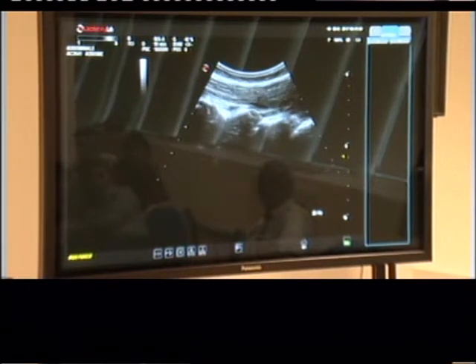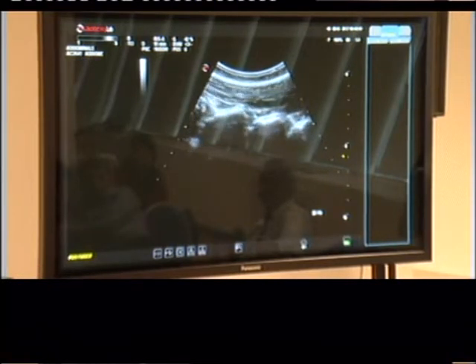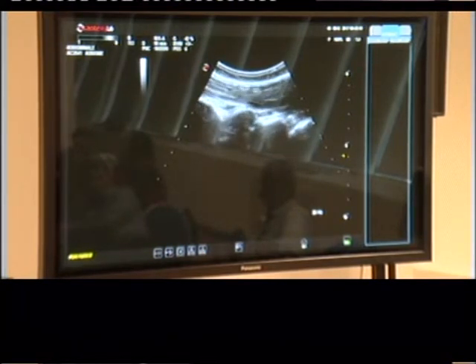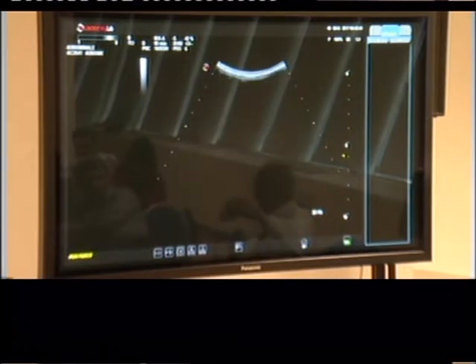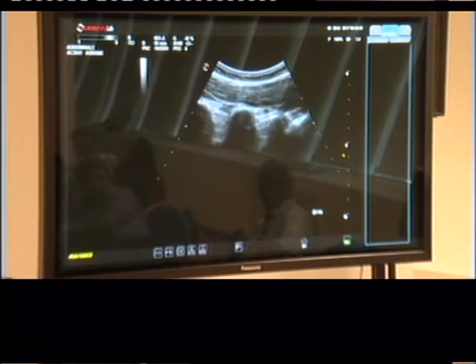Okay. So if I go back, there's the lamina. I go to the facets, and then I don't see anything down here. That's the facet, it's the roof. That's important because if you see anything, now your needle can go epidural, or, you know, nothing good. So the facets. Now I'll go slightly more. I'm going to paintbrush slightly more. So we'll have lamina, facets, and now nerve root.